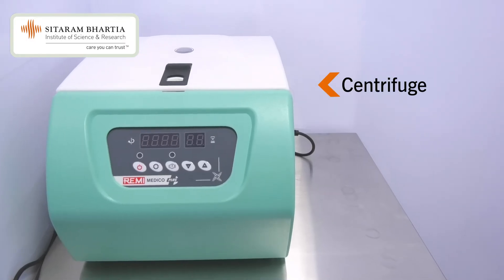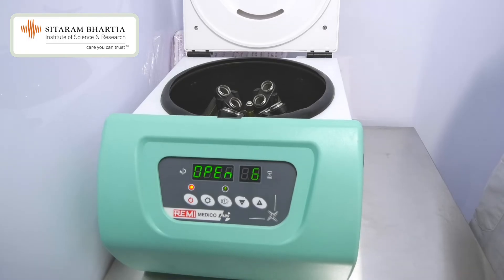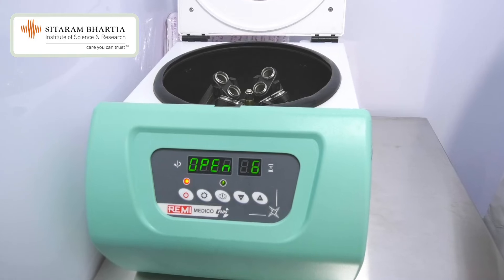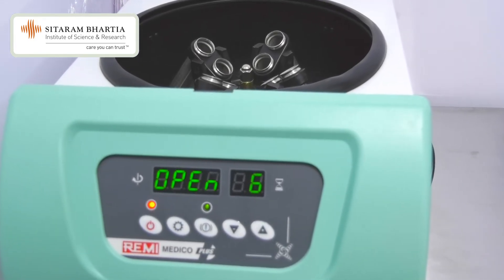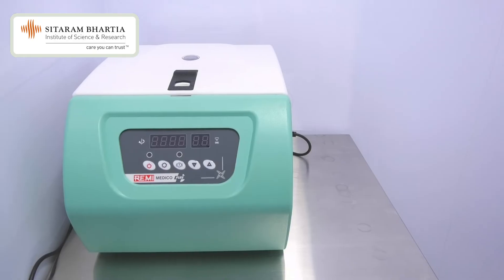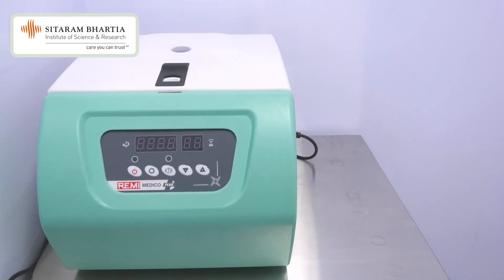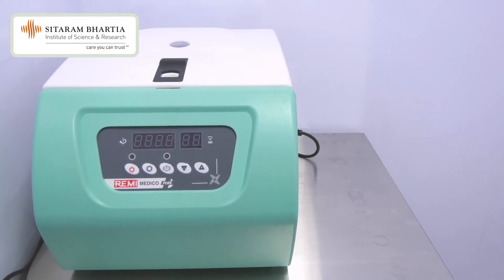This is a centrifuge. It has a lid which can be locked. This runs at various speeds. And it has, you can see, eight containers for test tubes in which the semen sample is properly labeled. And then it is run at a certain RPM — we call it rotations per minute — and this is used for preparing the semen to be used for so many procedures.